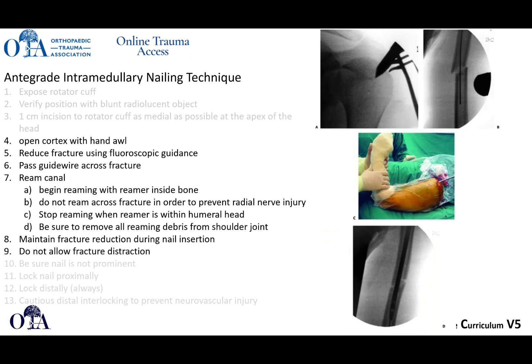Open the cortex, oftentimes with a hand awl. Reduce the fracture using fluoroscopic guidance. Pass the guidewire across the fracture and ream the canal — always start the reamer inside the bone. When you get to the fracture site, you usually want to push the reamer across to try to prevent radial nerve injury. When in the humeral head, try to stop reaming and pull it out by hand. Try to clean out all the debris and make sure it's not getting into the subacromial space. Maintain fracture reduction during nail insertion so that you don't cause additional iatrogenic fracture.